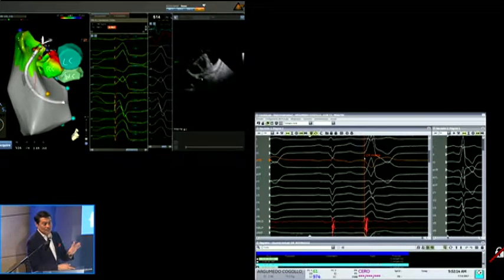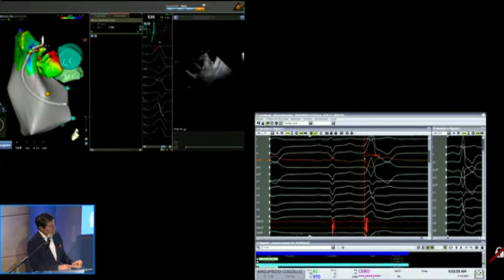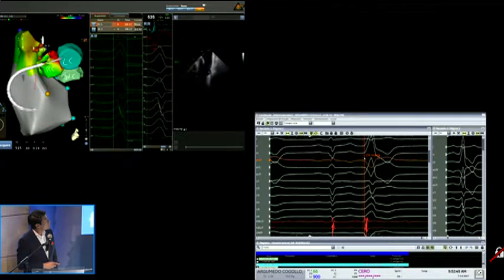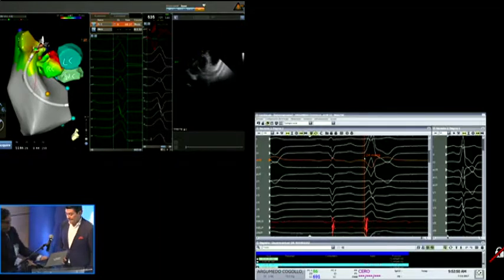Well, in general, when you're there and you have a pace mapping and you have some activation, you make an application. Any more questions? No, just a comment. The unipolar, I think that it's better on the right side than the left side. I don't know if you can compare. Would you like to compare in the polygraph? The negative deflection is on the right side.